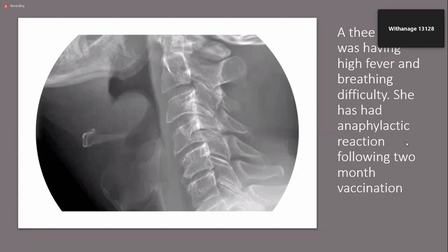The child will be septic, sir. Yeah, the child is very ill and septic, with a very high fever in epiglottitis, whereas a croup child will not be that ill. Otherwise all right most of the time, with low grade fever and coryzal symptoms. What is the other main difference? Swallowing difficulty in epiglottitis, right? In epiglottitis, there's severe inflammation around the epiglottis, so the child can't swallow.